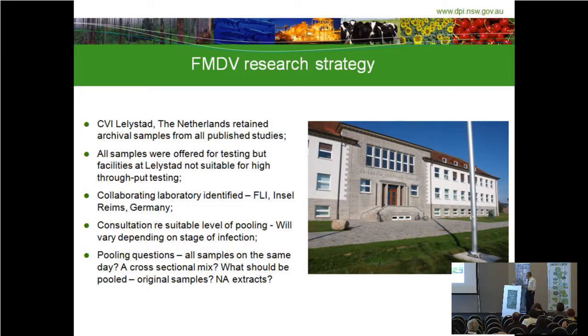So we discussed the planning of this project. We said, how are we going to pool these samples? What should we do? I spoke to the epidemiologists. Everybody had a range of ideas. Should we pool the extract? Should we pool the samples? How do we go about this?